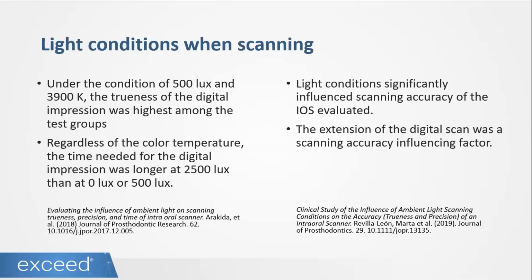Most of the time, this has to do with our impressions. And I'm not going to get into details here because we don't have enough time. But the scanners that you use are going to be affected by the light. This means that there are scanners that are only going to operate well if you are working almost in a dark room. There are other scanners that work well with different types of luminosity. So this is something that we need to know. We need to know how our scanner is going to perform the best.